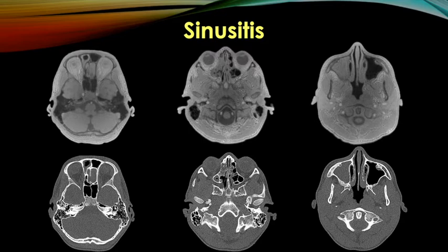Chronic sinusitis is an interesting application because these patients tend to get several follow-up CTs over the courses of their lives. I do have to provide the caveat that MRI is inherently resolution limited. So for a conventional MRI platform, the best spatial resolution you could get in a reasonable imaging time would be about 1 millimeter or just a little bit better. So therefore, some very thin areas of bone, like in the paranasal sinuses or the temporal bones, can be a little bit hard to see, but nevertheless, you actually get some good suggestion of microstructure and certainly hyperostosis and degree of overall disease is well demonstrated.